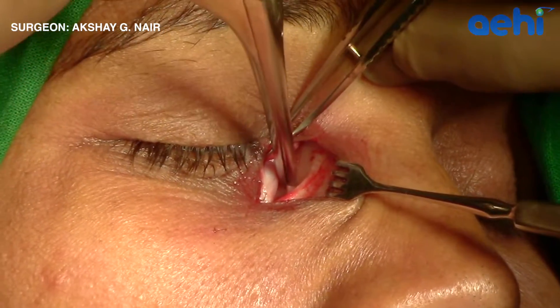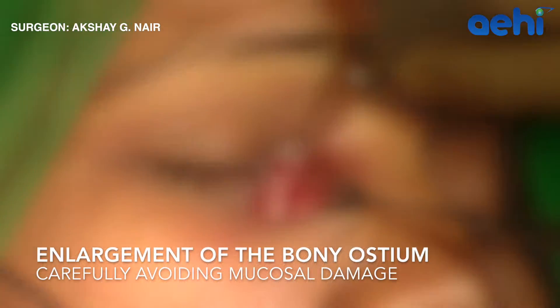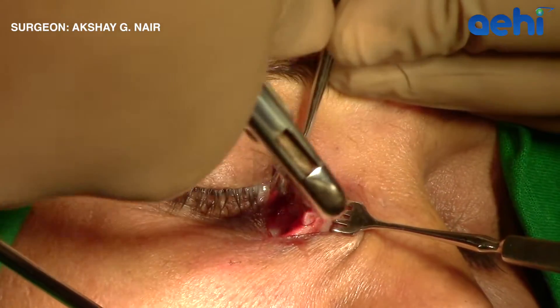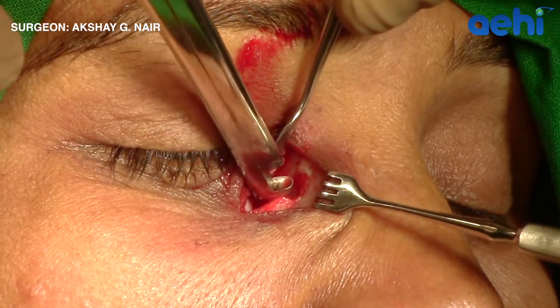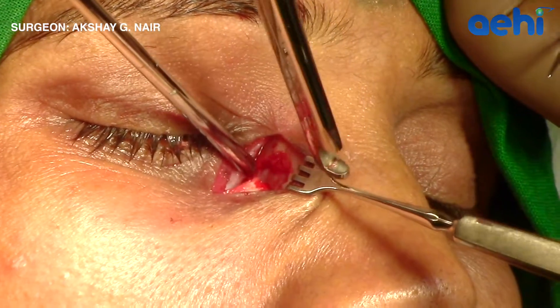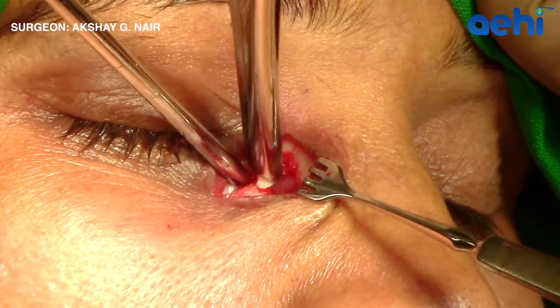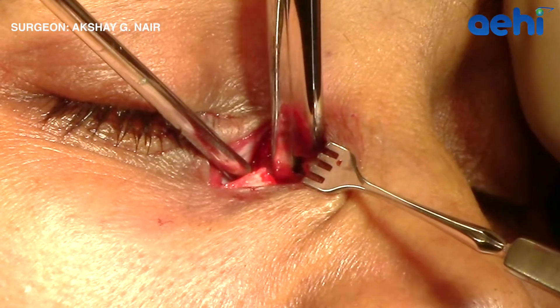A bone punch is then introduced and the ostium is gradually enlarged in all directions. Carefully pushing the lacrimal sac away is important while punching the bone. While the handles of the bone punch are being pressed after engaging the bone, it is important to have a rotational movement at the wrist joint to allow for easy dislodgement of the bony fragment. Damage to the mucosa can result in torrential bleeding, so carefully pushing the mucosa down and engaging the bone within the punch is important.